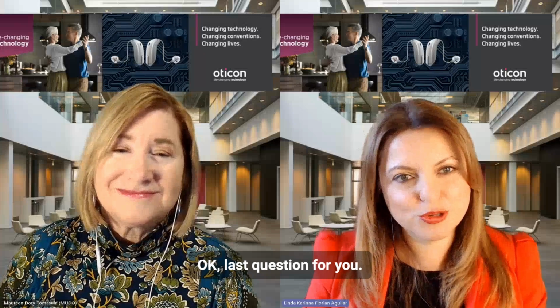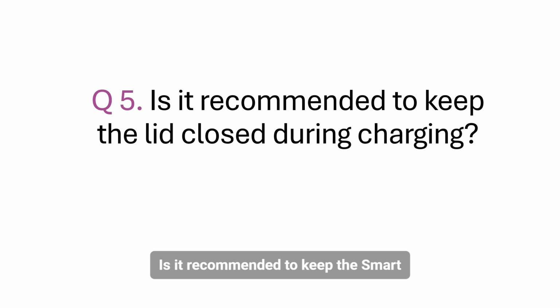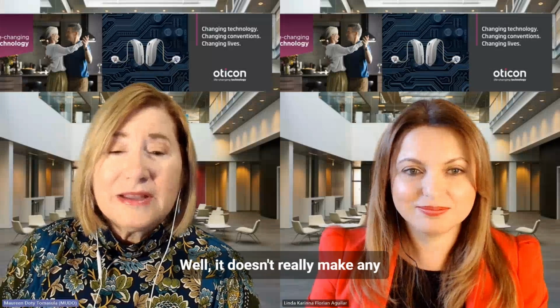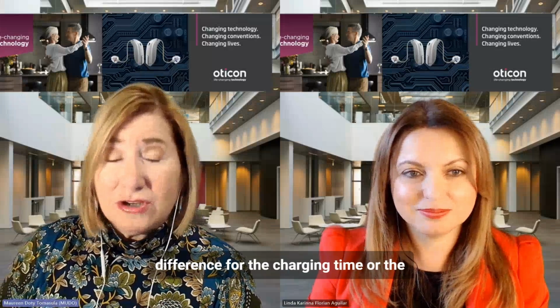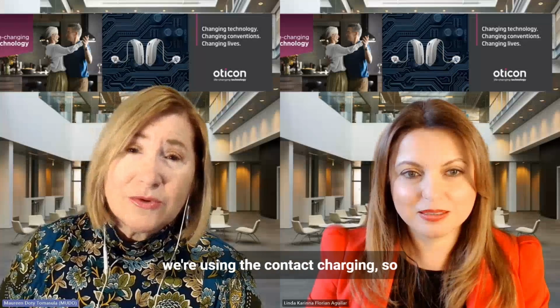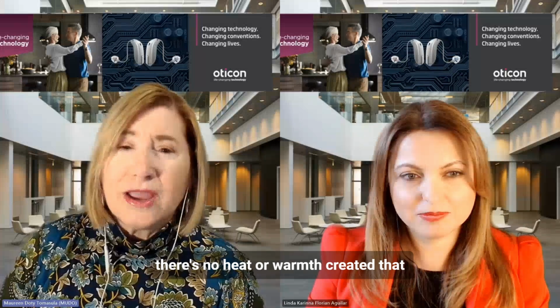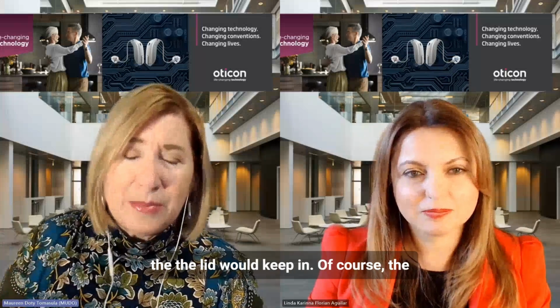Okay, last question for you. Is it recommended to keep the smart charger closed during charging? Well, it doesn't really make any difference for the charging time or the health of the battery because, again, we're using contact charging, so there's no heat or warmth created that the lid would keep in.